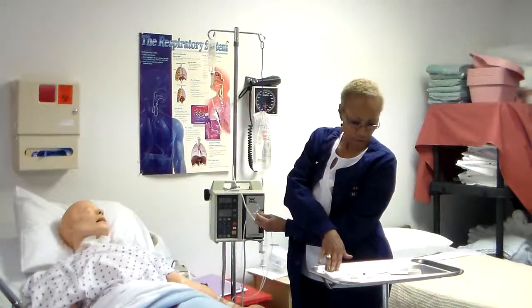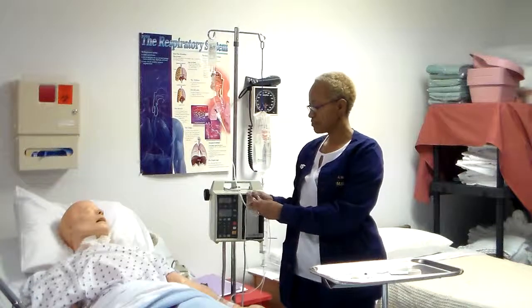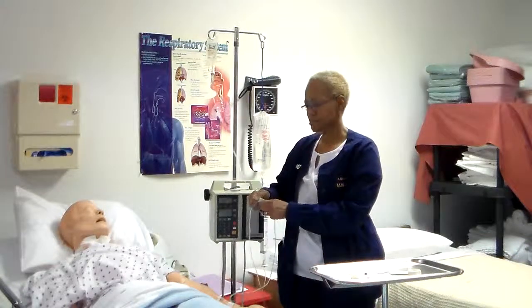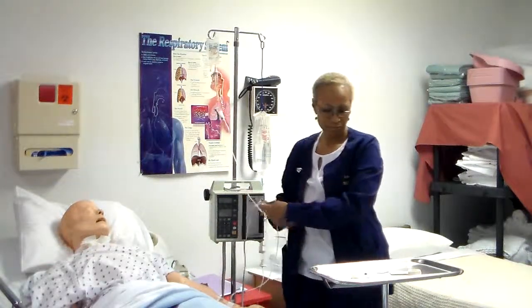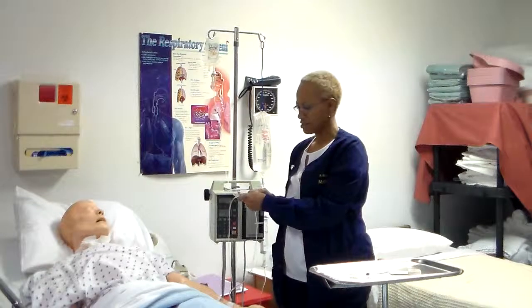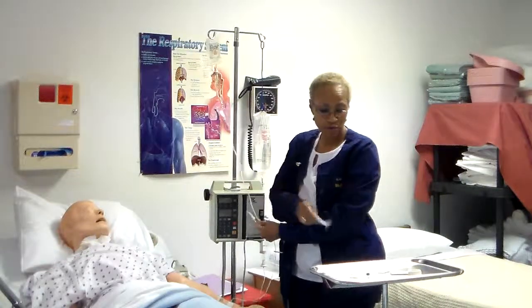There are three ways you can connect your end piece. Stopcock: wipe off stopcock port with alcohol swab and connect tubing. You can use a stopcock, which we're not using today. The second way is a needleless system. We had a needleless system, and I think you used the needleless system when we were doing blood.